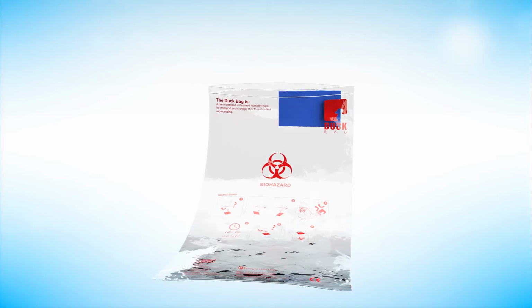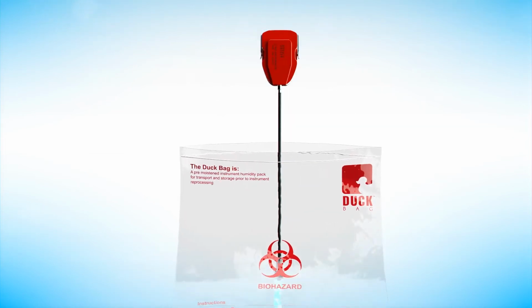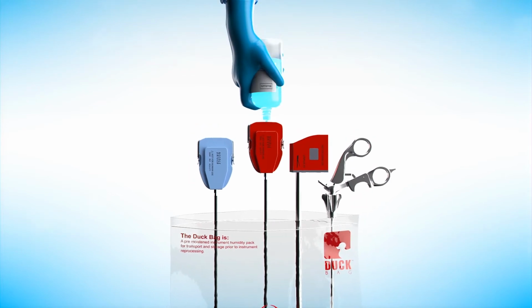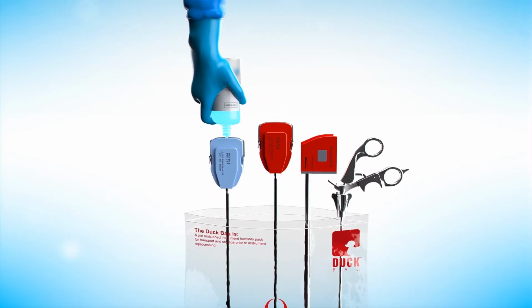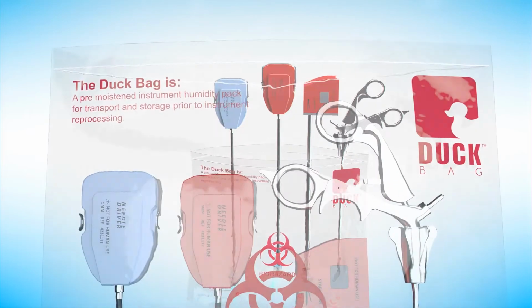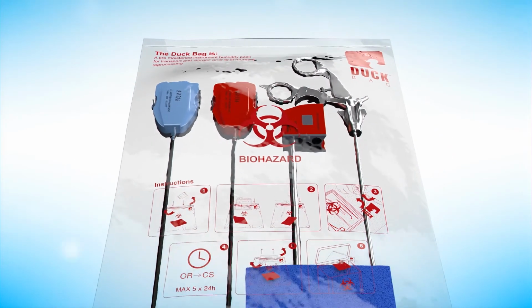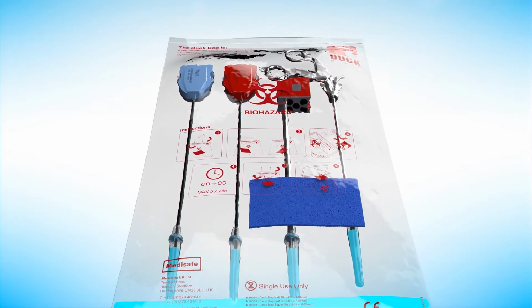Place the sponge in the duck bag provided, followed by the devices. Using the bottle of enzymatic detergent, squeeze into the primary flush port until full on each device. Empty the remaining detergent into the bag, sealing it shut. The sealed bag will keep the instruments moist during transit.